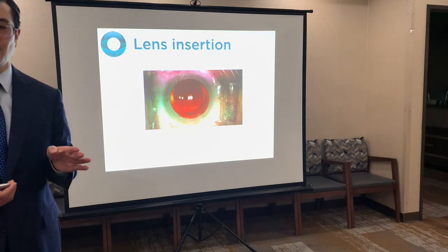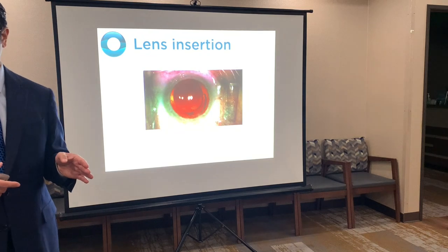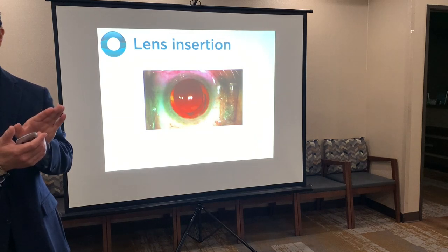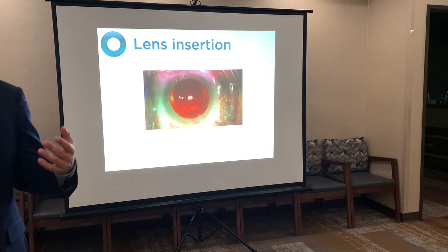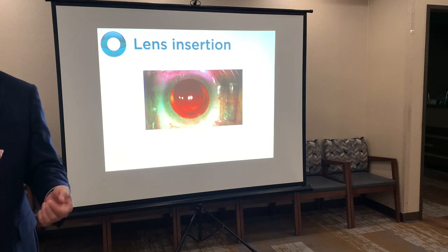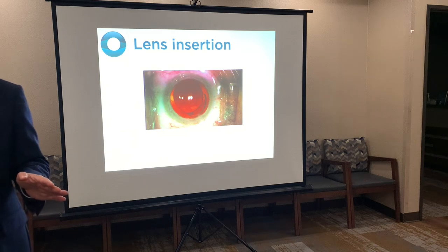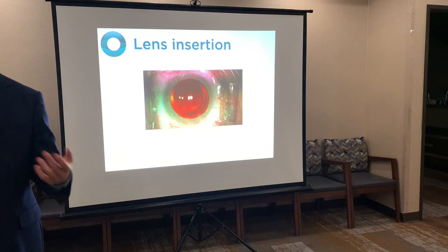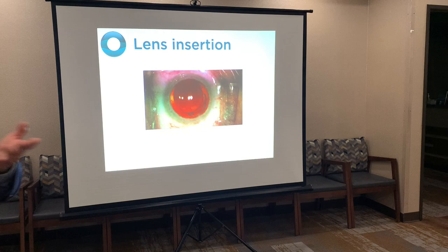You have two options at that point. Either A, make sure no more viscoelastic is in the bag, both in front of and behind, and you really want to seat the lens onto the capsule so it sticks there and doesn't rotate. Or B, you can take that lens optic and do reverse optic capture, because sometimes that makes it a bit more stable. You have to make sure the patient doesn't do any heavy lifting, and that there are no pressure spikes or issues afterwards, because you would hate to have to reposition more than once. Actually, you hate to reposition even once.